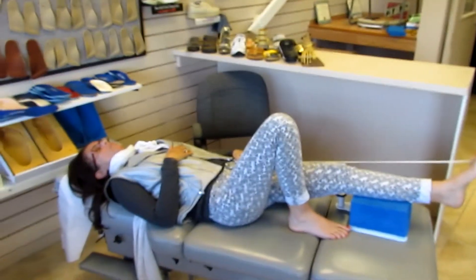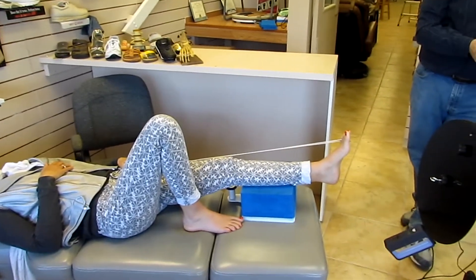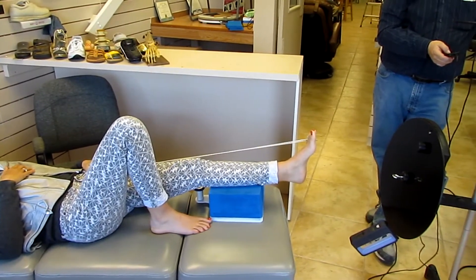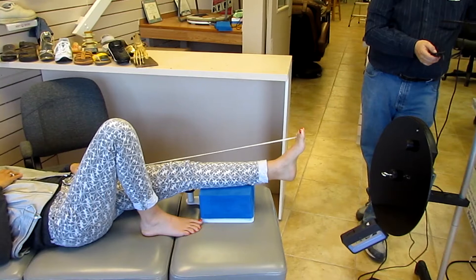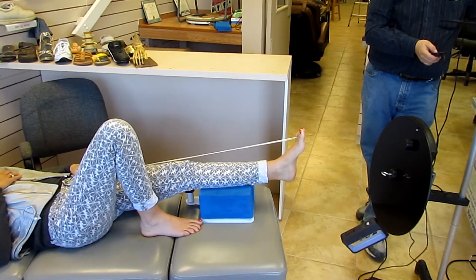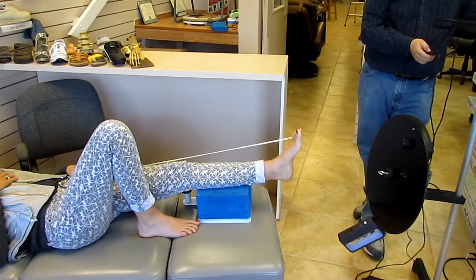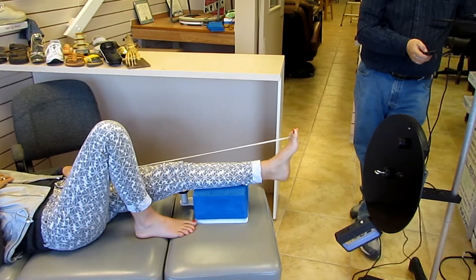Our patient is lying supine on the chiropractic exam table. Her leg has been placed on the casting block, and her foot has been put into subtalar neutral by Mr. Arch, using a string or ribbon that the patient is holding to maintain that position.